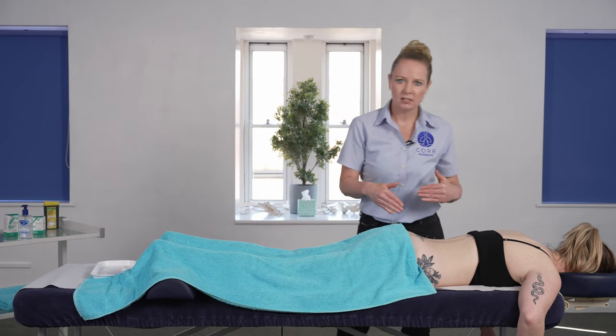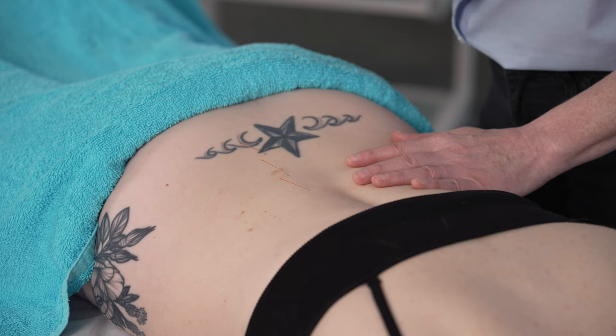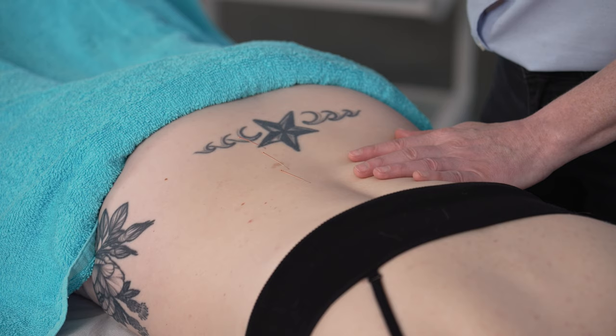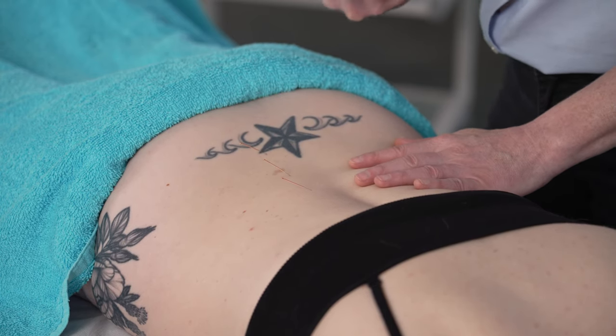Always put all our needles in first before going into activation of the needle. That gives the client a chance to get used to that needle sensation and gives the body enough time to relax and get used to the sensation as well.